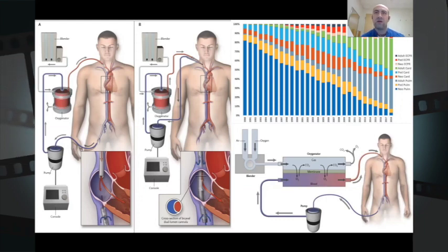Here you can see two of the three main VV-ECMO cannulation strategies. The leftmost image is a femoral internal jugular strategy, and the image directly to the right of it is a dual lumen cannula strategy with an inflow in the SVC and IVC and an outflow directed toward the tricuspid valve. The third strategy is a femoral cannulation with one caudad drainage cannula, usually positioned below the IVC, and one cannula in a more cephalad position near the cavoatrial junction, returning the blood after it's been oxygenated.